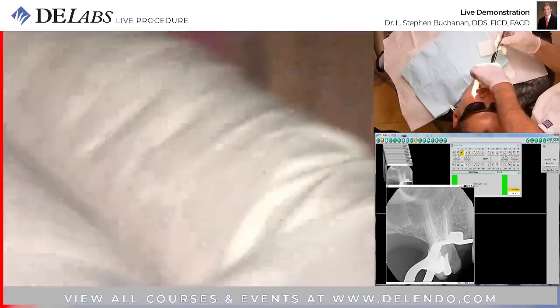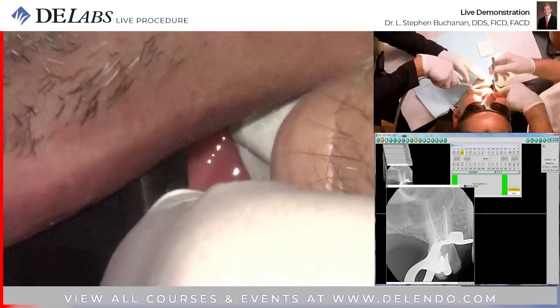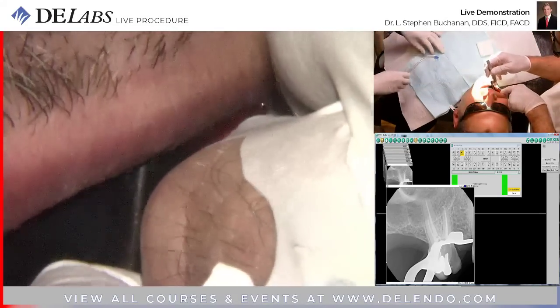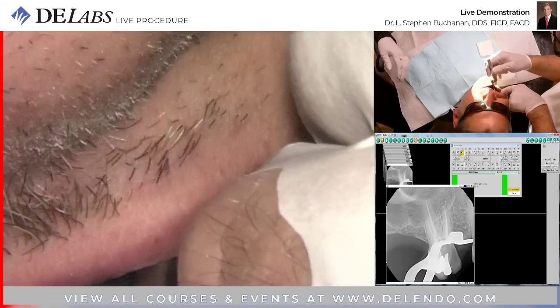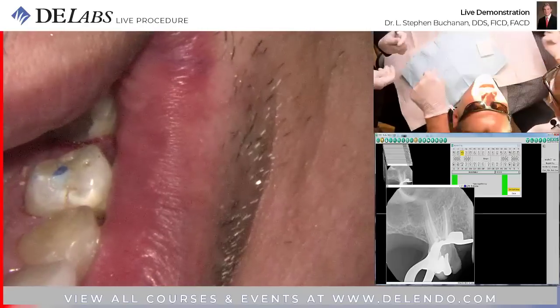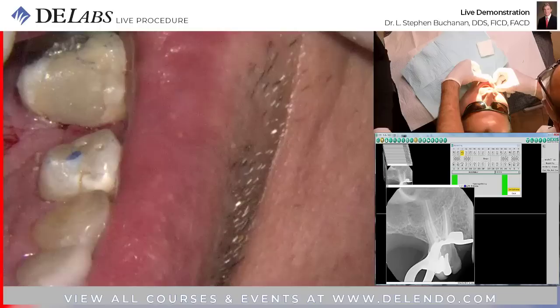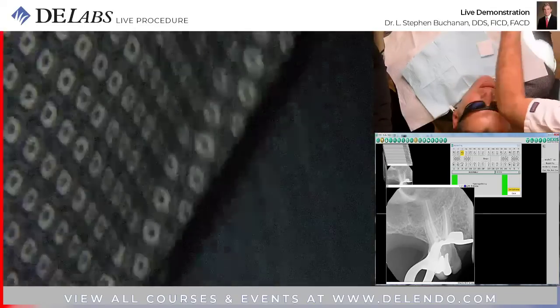Okay, close down. You close down and tap, tap, tap on the tooth, make sure we don't have a high spot? None. Okay. Yep, that's the mesially adjacent tooth. Nothing on that one. Okay, let's get some post-op images.